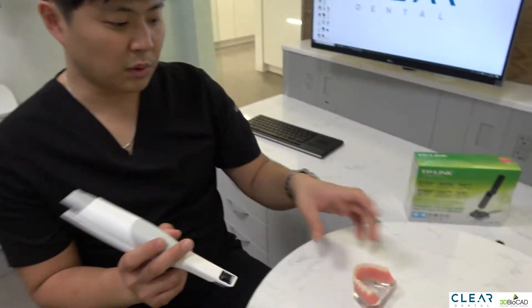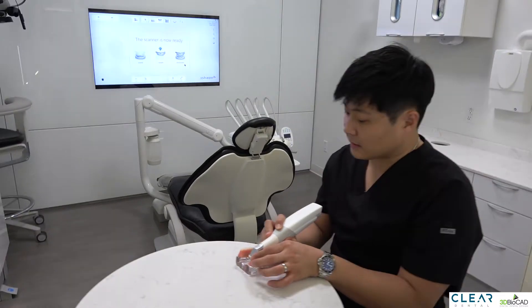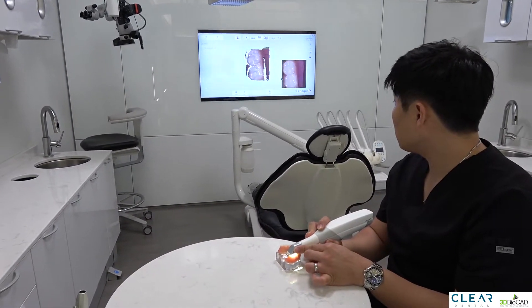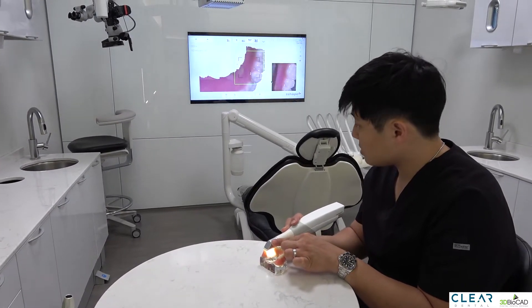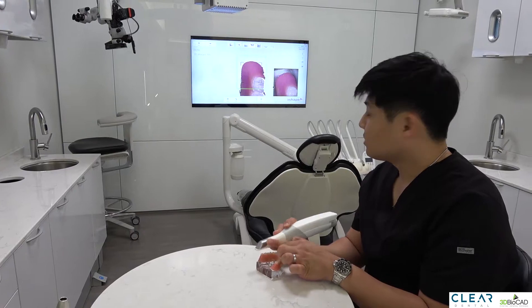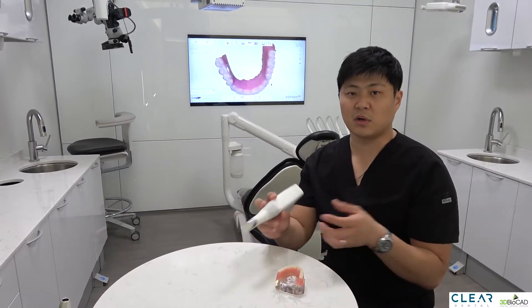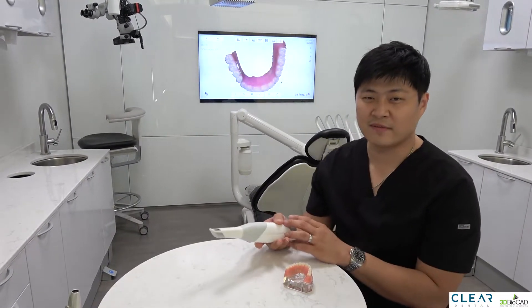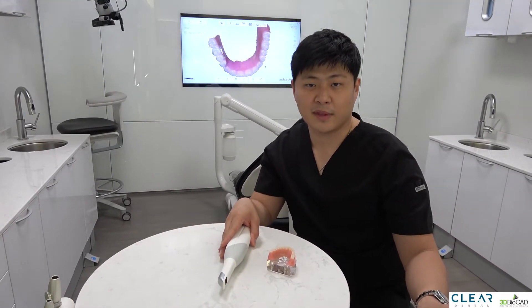Now let's actually scan something to show you the speed. I'm just going to scan a denture. As you can see, the speed of the scan is probably similar to the wired scan. As we use it more often we'll know if it's as good as a wired one, but so far we've been very happy with it.